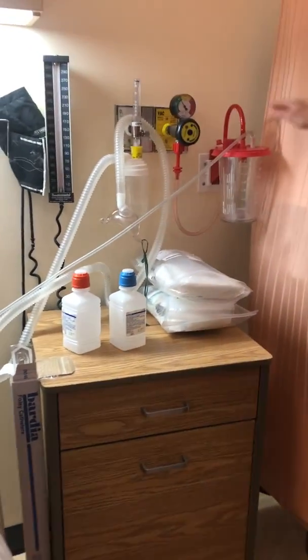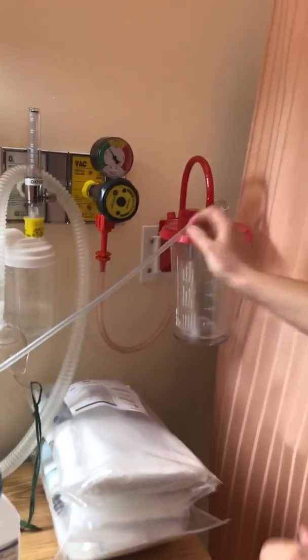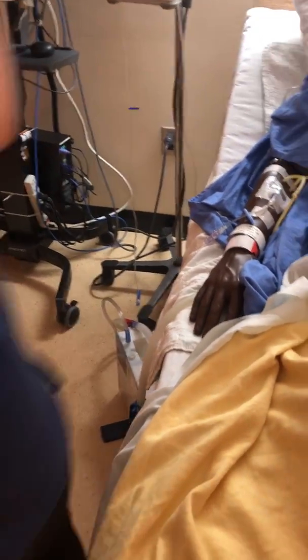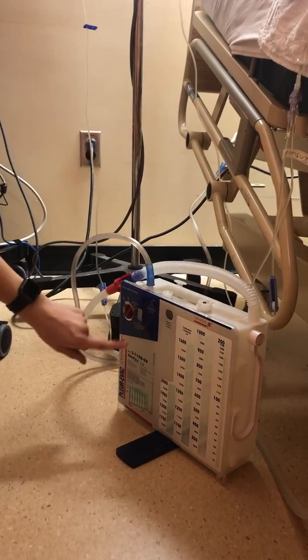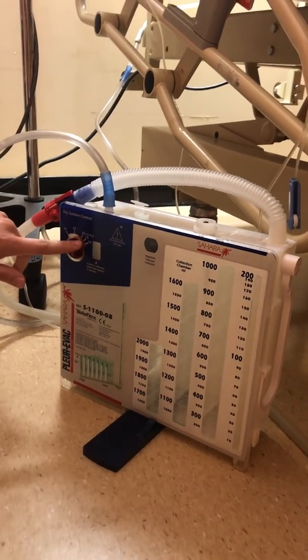I've checked over here that the suction is on and set to low suction. It's in the green, so that's good. So then I want to follow the tubing all the way to the other side here. Making sure nothing's kinked or plugged, everything's connected properly. Good, so I follow it here to my Pleur-evac. So with this, I'm going to check that the orange ball is visible, and it is. I'm going to check that the dry suction is set to 20 centimeters of H2O.